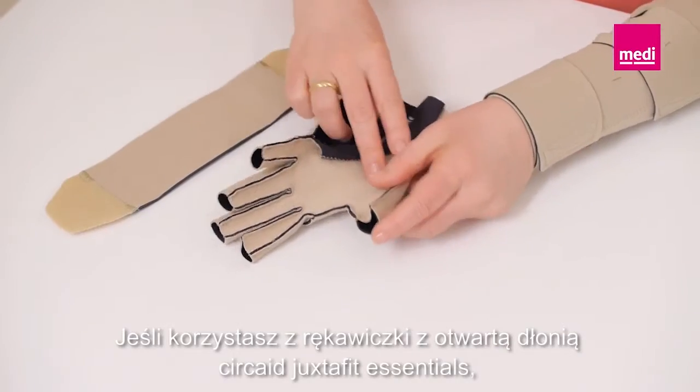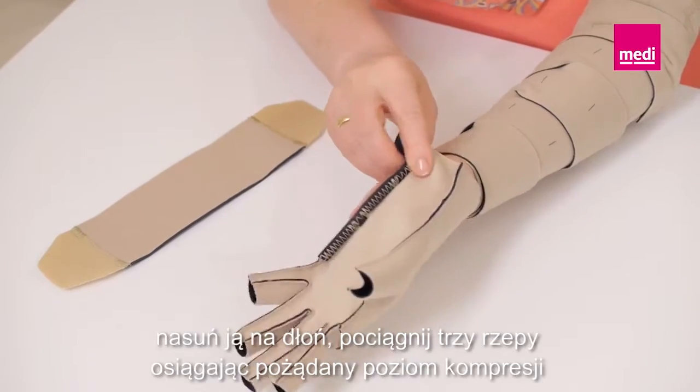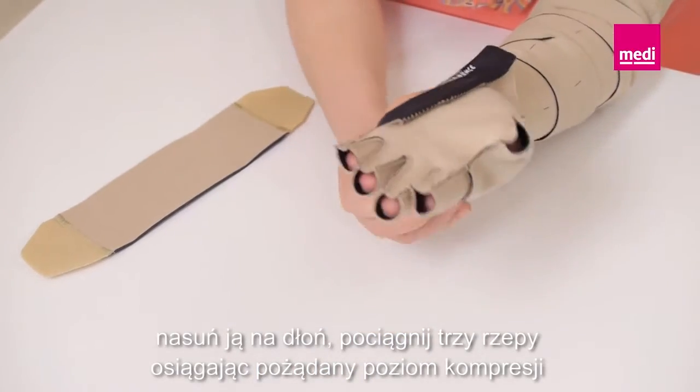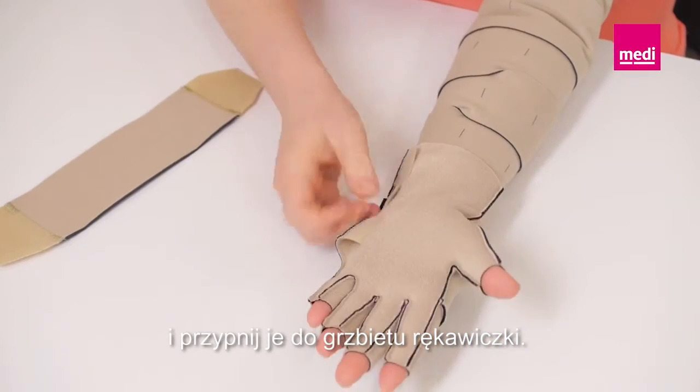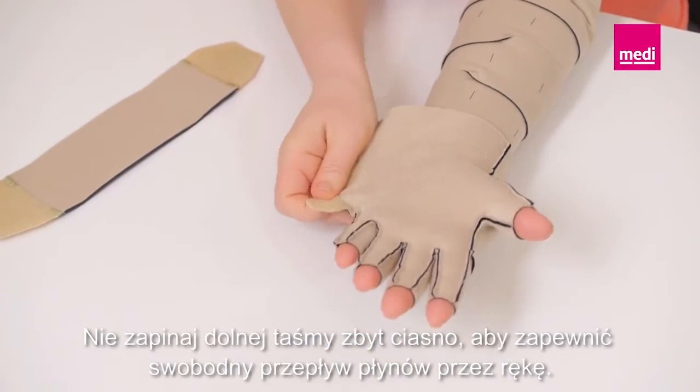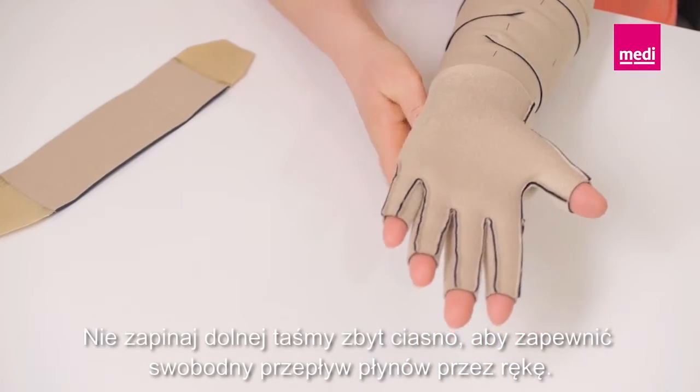If using the Circade Juxtafit Essentials open palm glove, slide it onto the hand. Pull the three Velcro tabs to the desired level of compression and fasten them to the dorsum of the glove. Be sure not to over-tighten the glove's bottom tab so that fluid can freely move out of the hand.